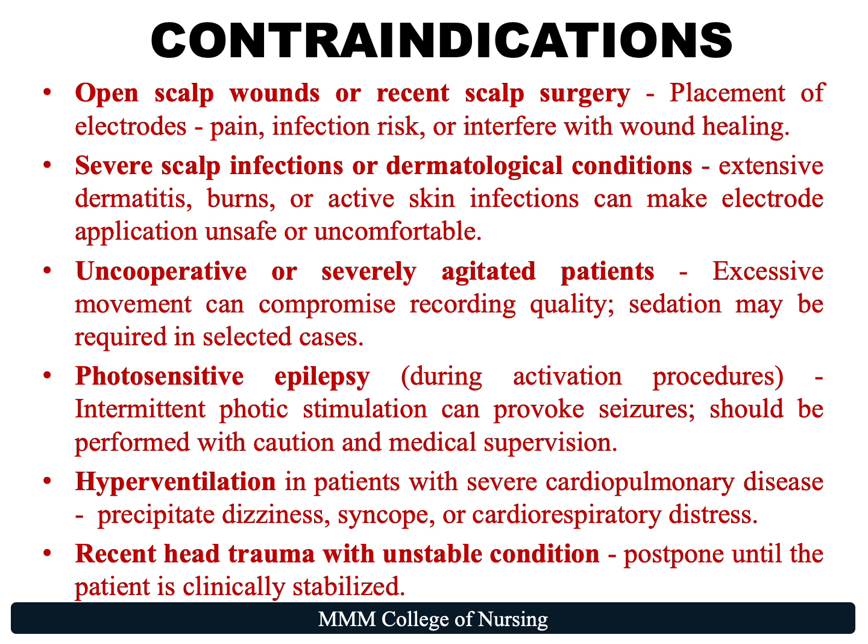Let's look at them. Open scalp wounds or recent scalp surgery. Here, the placement of electrodes may cause pain, infection risk, or interfere with wound healing. The next is severe scalp infections or dermatological conditions such as extensive dermatitis, burns, or active skin infections, which can make the electrode application unsafe or uncomfortable. The next is uncooperative or severely agitated patients, where excessive movement can compromise recording quality, and sedation may be required in selected cases, especially in pediatrics.